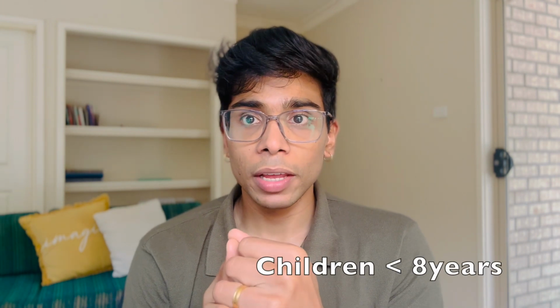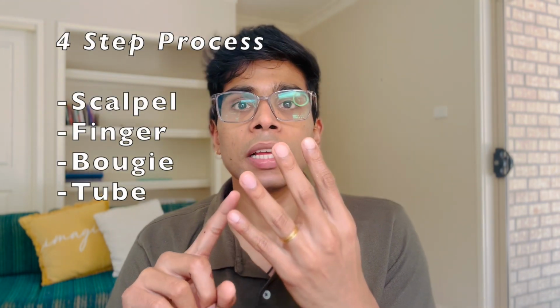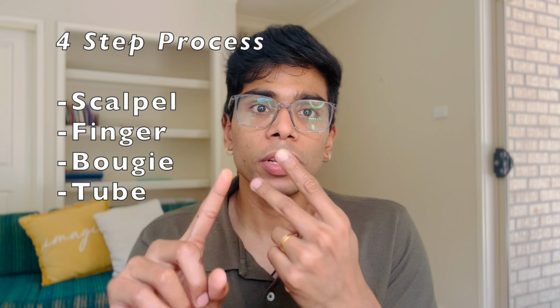Three, if there are children, less than 10 years, specifically less than 8 years of age, try not to, or do not, go ahead with a surgical cricothyrotomy. In these people, a needle cricothyrotomy is a preferred approach because cutting through their trachea can often lead to complications, including collapsed airways. Numerous techniques have been described, but my preferred approach is what I like to call the four-step process: the scalpel, the finger, the bougie, and the tube approach. It's a very straightforward process and lets you run through steps in your mind quite easily as well.